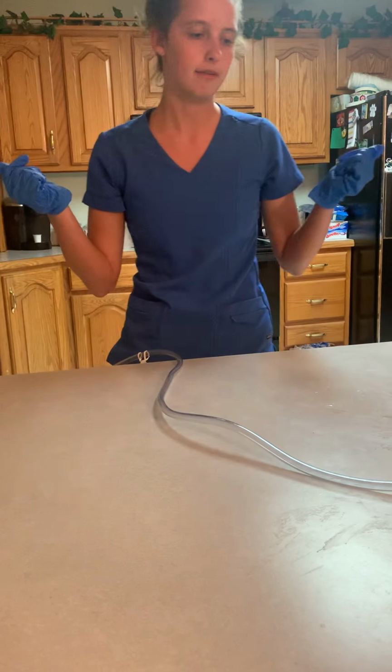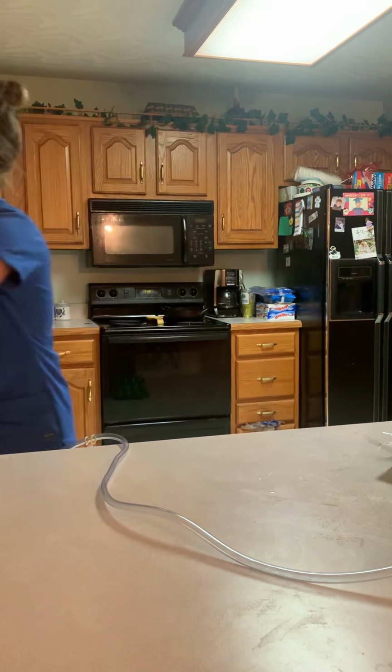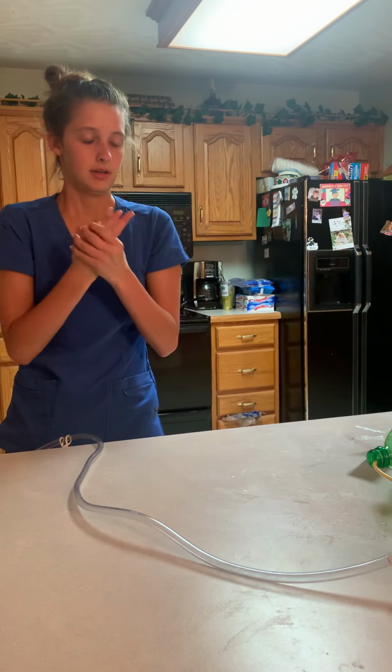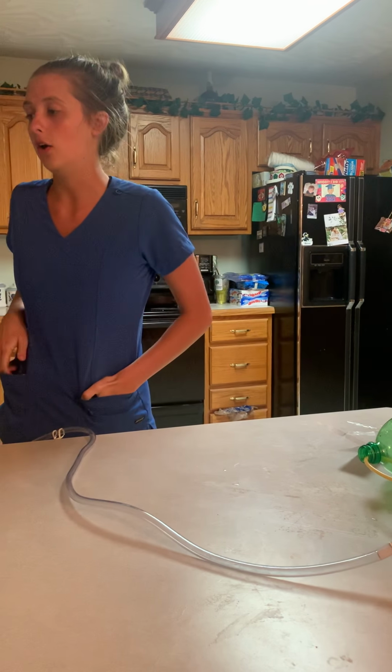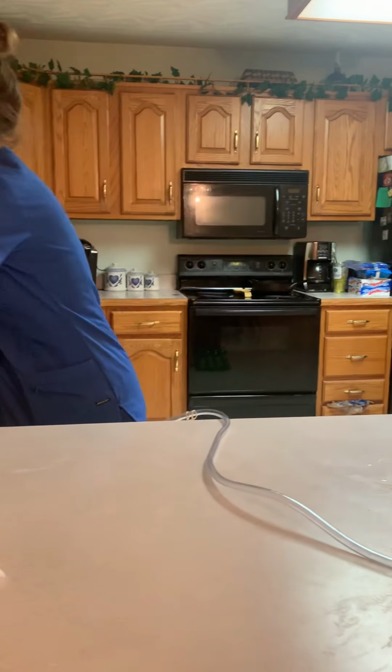Okay, so now that we have that done, I'm going to remove my gloves. I'm going to wash my hands. And then I am going to raise up the side rail that's closest to me, and I'm going to lower the bed back down to its original position. I will make sure the patient is comfortable. And now I'm going to document.